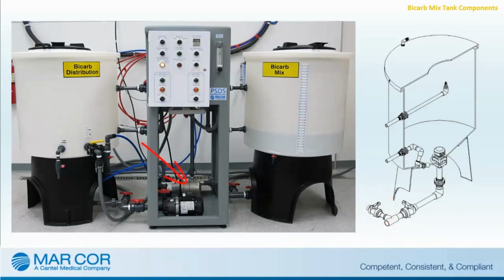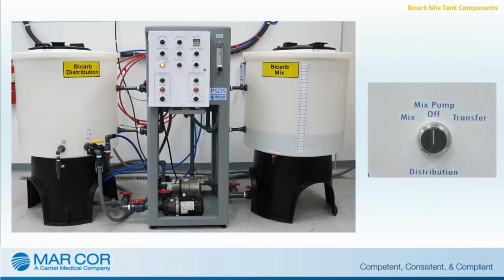The mix pump provides for mixing of bicarbonate powder into solution and transfer of the mixed solution from the mix tank to the distribution tank. The mix pump is controlled with a timer that will shut down the pump after 10 minutes of operation to minimize the potential of overmixing. If more than 10 minutes of mixing is required, the hand switch will need to be turned to the off and back to mix to resume mixing.